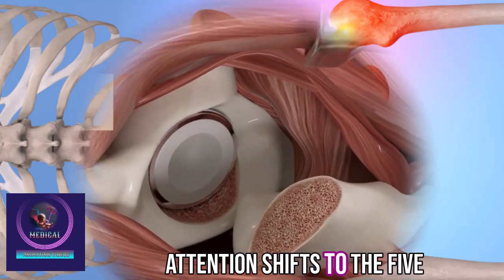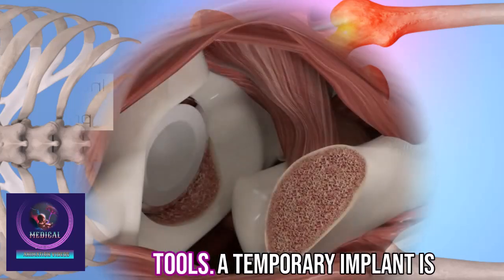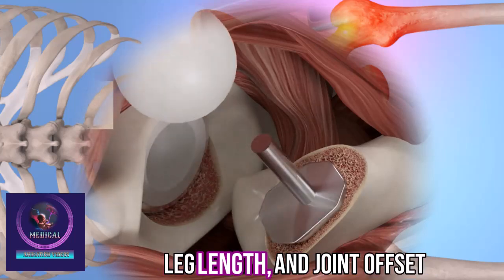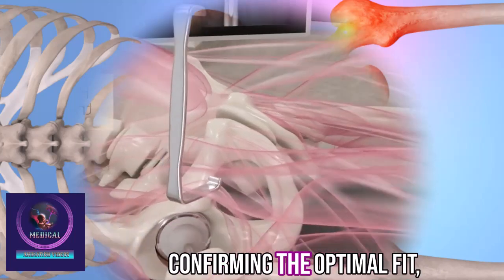Attention shifts to the thigh bone femur, where the surgeon prepares the inner canal using bone conserving tools. A temporary implant is inserted to assess and optimize the hip's alignment, leg length, and joint offset with the aid of x-ray and navigation systems.